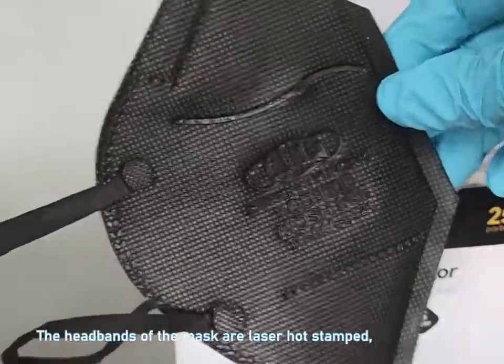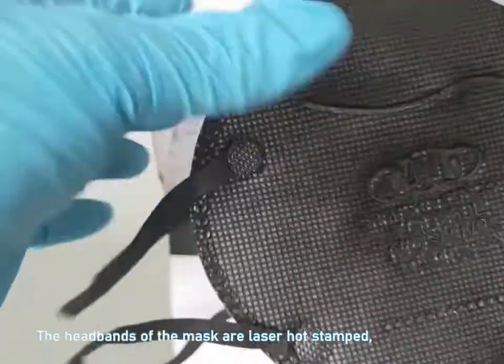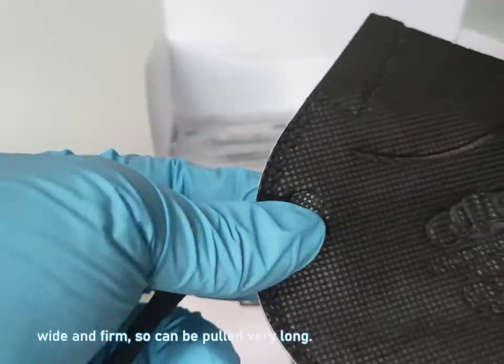The headbands of the mask are laser hot stamped — wide and firm, so they can be pulled very long.